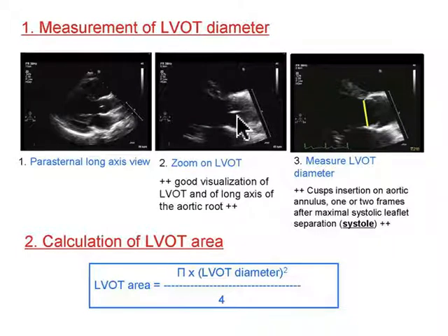The leaflets are together. So in that frozen state, you can then take the dial, bottom left-hand button, and you can rotate that dial counterclockwise, and you'll back up to where end systole was. And those valve leaflets, you'll watch them just kind of march right open. And once they're open at their maximal point, you can take a measurement using the calculations function between those two leaflets, and that's your LVOT diameter, your left ventricular outflow tract diameter.